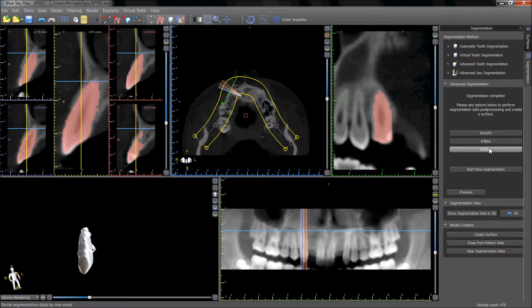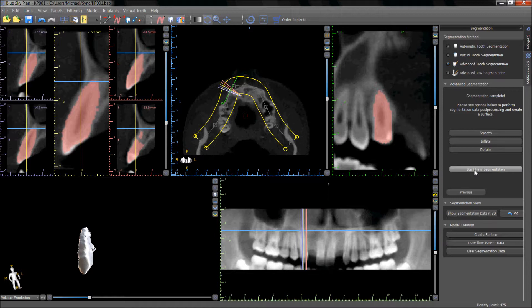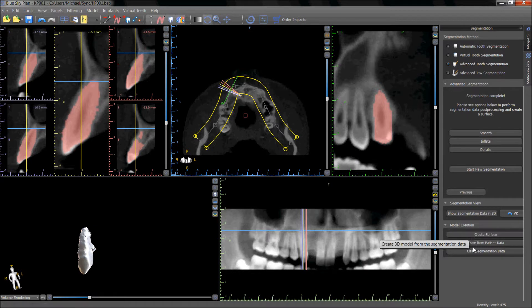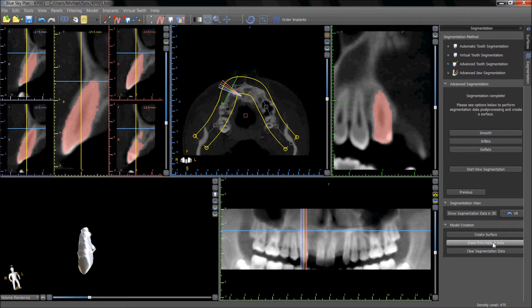If more exact modification is necessary, the previous button can be used to modify the segmentation. A new segmentation can be started by clicking Start new segmentation. Once we have the desired segmented tooth, we can once again decide if we want to create a surface and or erase it from the patient data.